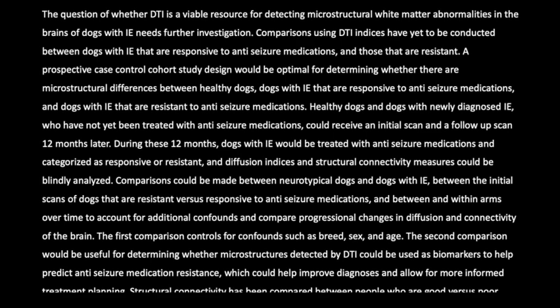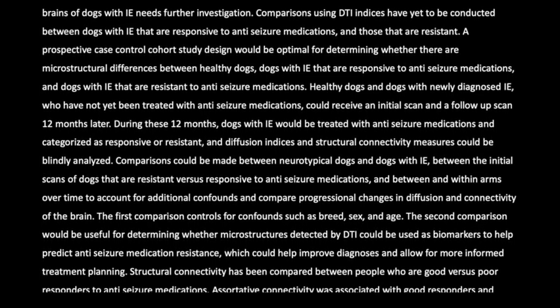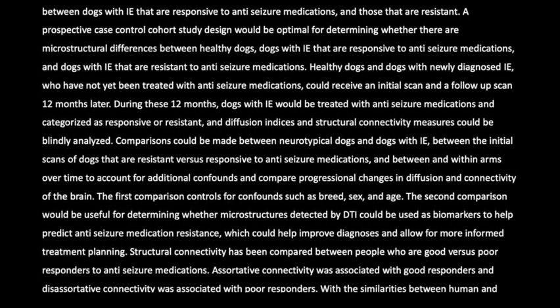Healthy dogs and dogs with newly diagnosed IE, who have not yet been treated with anti-seizure medications, could receive an initial scan and a follow-up scan 12 months later. During these 12 months, dogs with IE would be treated with anti-seizure medications and categorized as responsive or resistant, and diffusion indices and structural connectivity measures could be blindly analyzed.